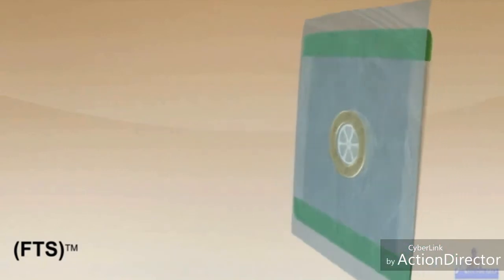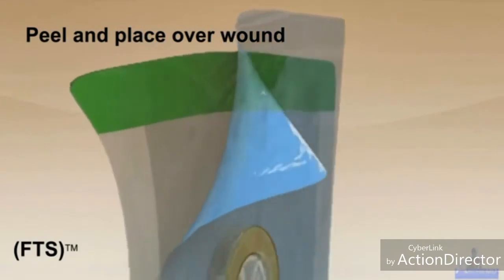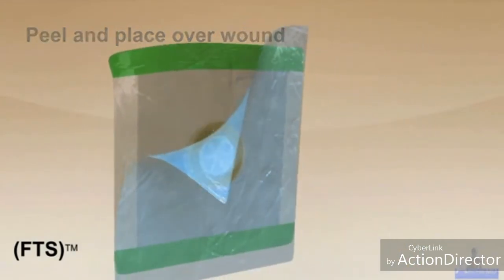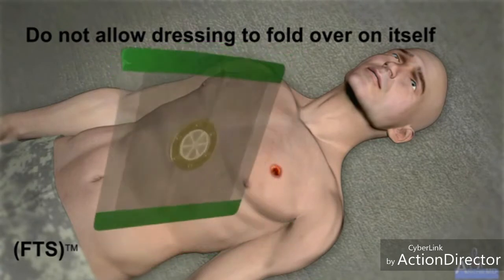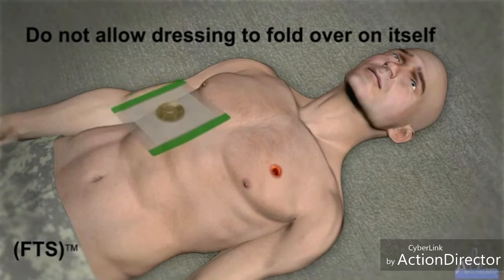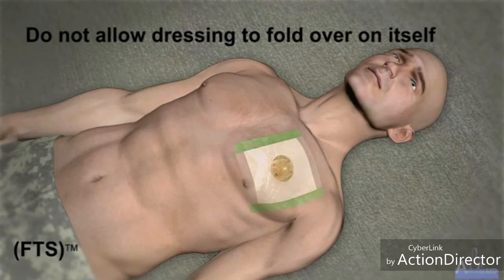Peel and place over wound. To place, grip green tab and remove protective blue backing. It is important that you use care when removing the protective blue backing material. Do not allow dressing to fold over onto itself. Next, place FTS directly over wound. When positioning the dressing, center the valve directly over the opening of the thoracic wound. The entire defect should be covered.